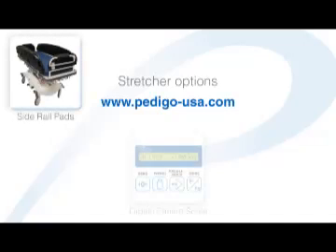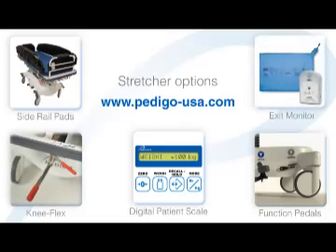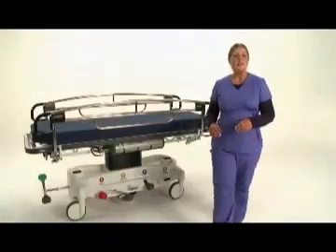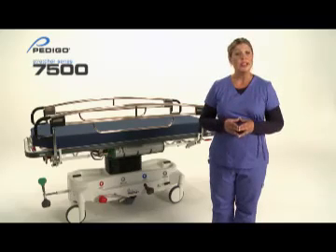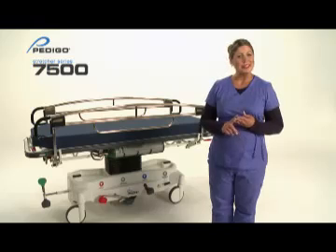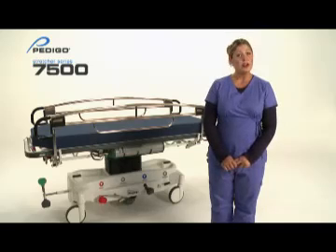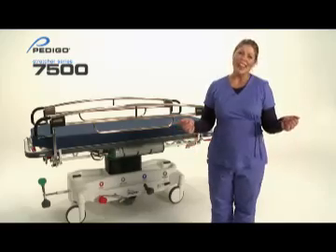For a complete list of available stretcher options, visit our website at www.pedigo-usa.com and customize your 7500 stretcher to match your department's exact needs. Pedigo's 7500 series stretcher allows for the transfer of patients easily and comfortably with an industry best of 750 pound weight capacity. Superior stability, mobility, and braking capabilities make the 7500 versatile for all your department needs, whether it be the OR, ED, PACU, patient transportation, radiology, or cath lab.